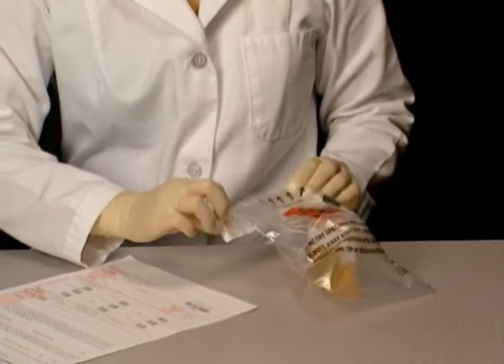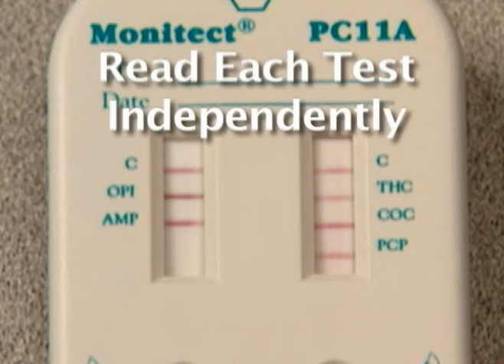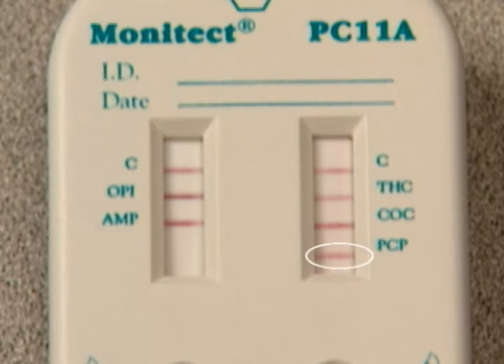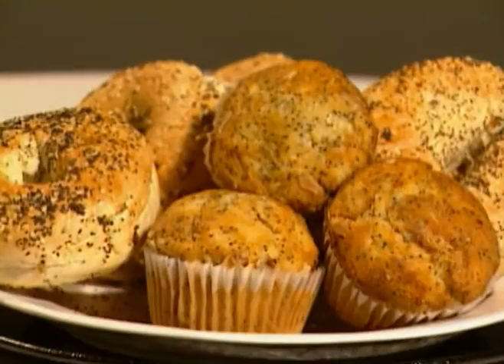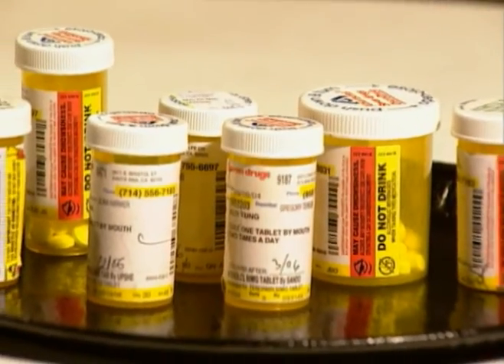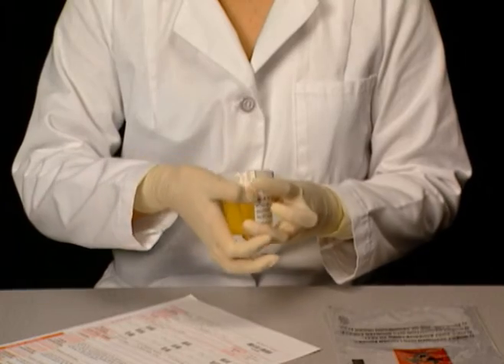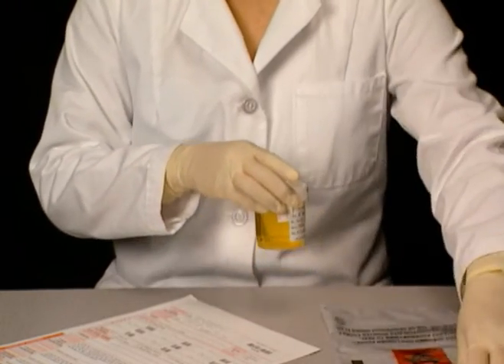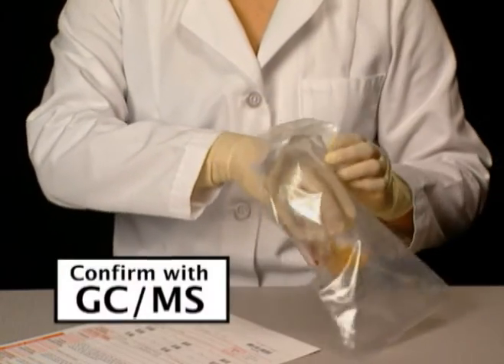If results are to be confirmed, follow the standard chain of custody procedures. It is important to read each test independently. Do not compare color intensity of one test to another. Samples with faint test bands at the test regions should be considered negative. Substances in certain foods and/or medications may interfere with the test and cause a cross-reaction. We recommend that samples indicating a presumptive positive result be confirmed with a more specific quantitative method, gas chromatography mass spectrometry.